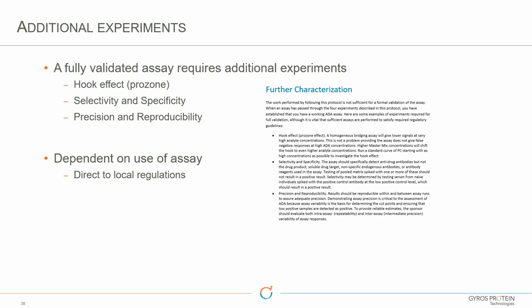I think one of the things that I've seen that creates the most problems for these types of assays is what's going on with your critical reagents. And I think we've talked a lot at the big meetings, the AAPS and so forth, about critical reagent maintenance and characterization and how important that is for the life cycle of your assay. So as with any platform, the quality of the reagents is going to bear quite heavily on the quality of the ultimate results for the assay.